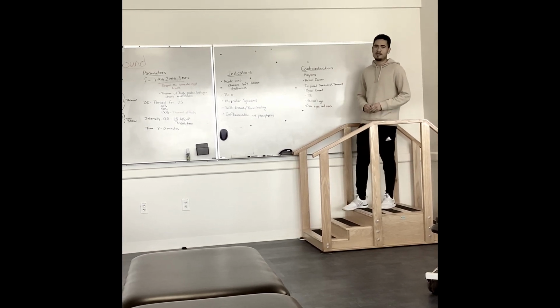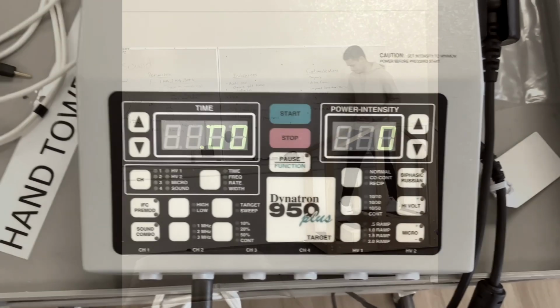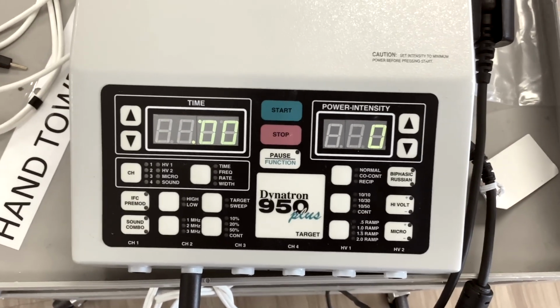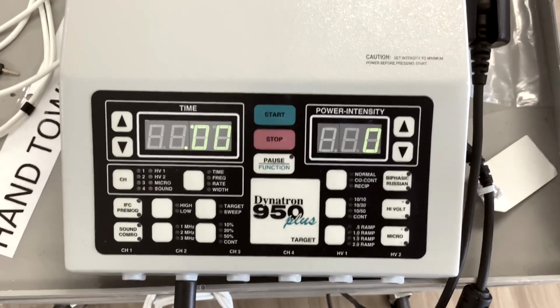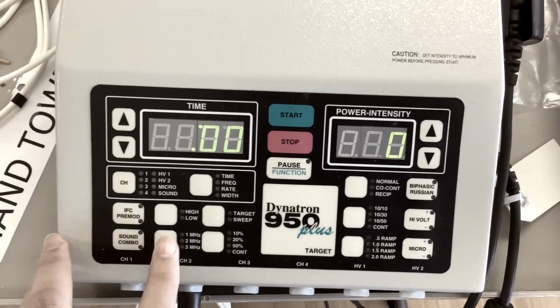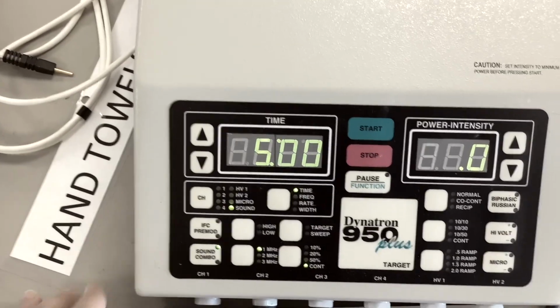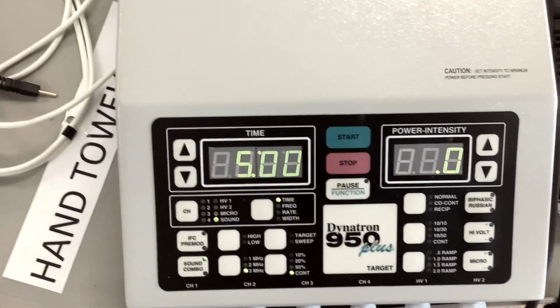So now we're going to look at a patient scenario on how to set up ultrasound and use it on a patient. Today I'm going to do ultrasound on Bonnie, who's a 26-year-old mother who was last pregnant 2 years ago, so no contraindications. To set up my machine, I'm first going to put it for sound. And then for frequency, I'm going to set it to 3, since it's superficial near her L5 vertebrae, I don't need to go that deep.